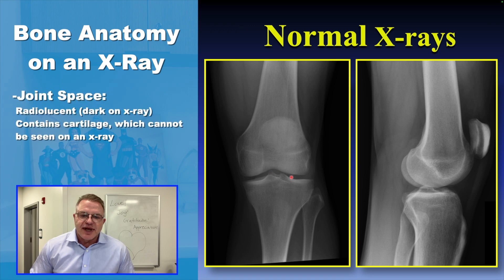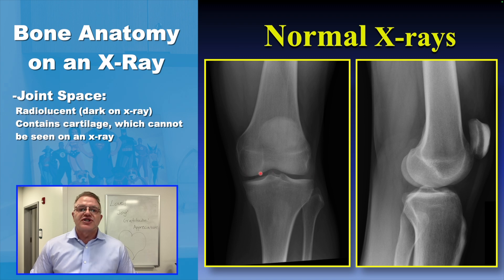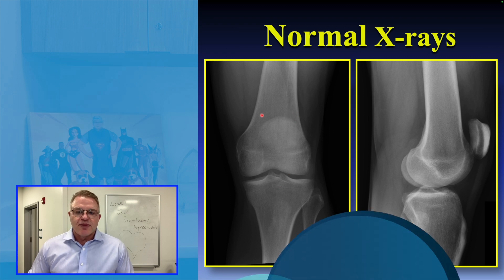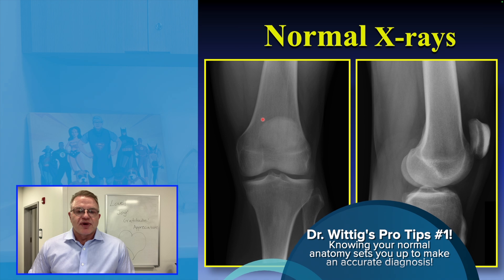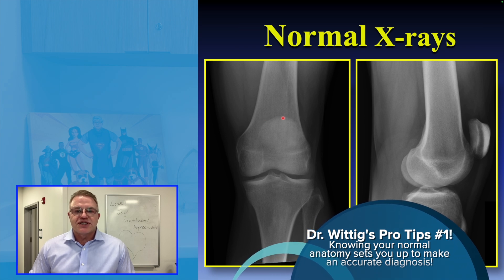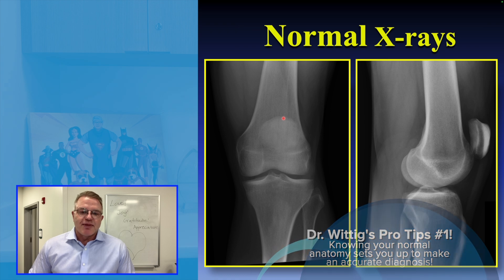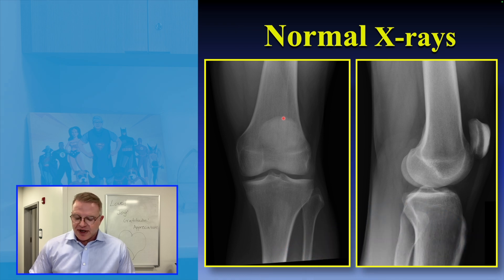This is the joint space. It's radiolucent, or dark, because there's cartilage there, and cartilage does not show up on the x-ray — just the bone does. This is all important to know because when we assess bone tumors, they can have different radiological appearances depending on the amount of bone they destroyed and how fast they are growing.